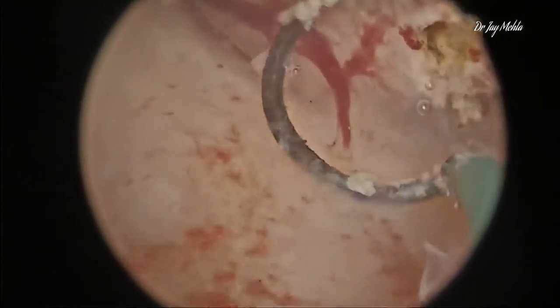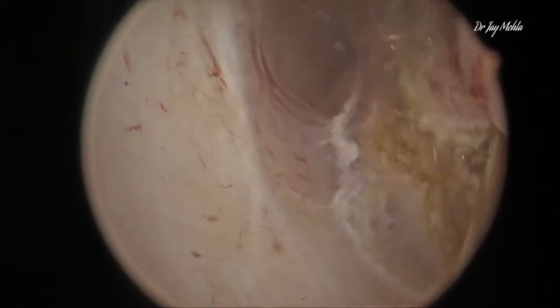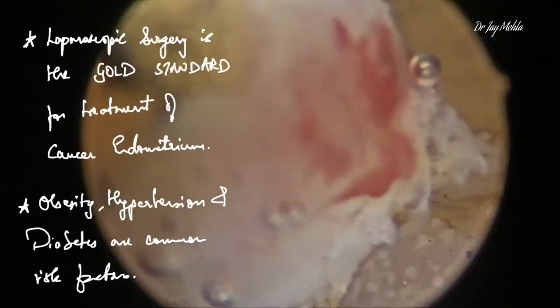One can also add spectral light to it, but it is so important because it helps in establishing a very firm diagnosis as well as pointing it out and counseling the patient. This is a very good technique, daycare without anesthesia, and can be offered as an alternate to ultrasound and an MRI to all the patients.